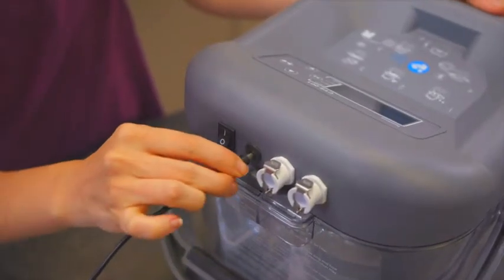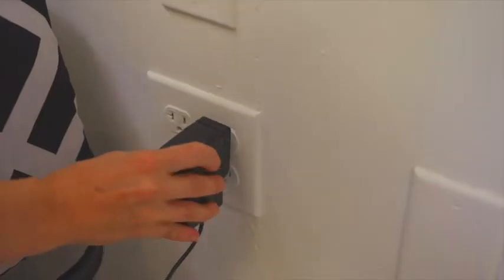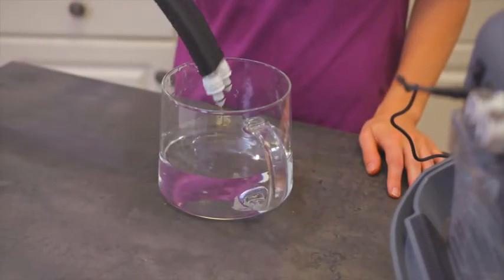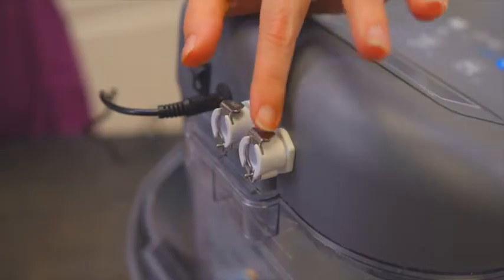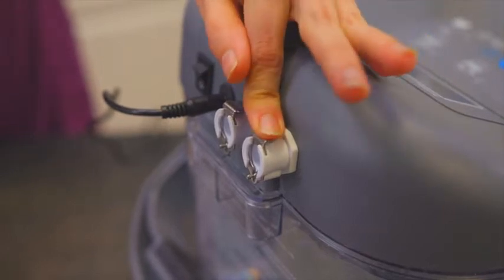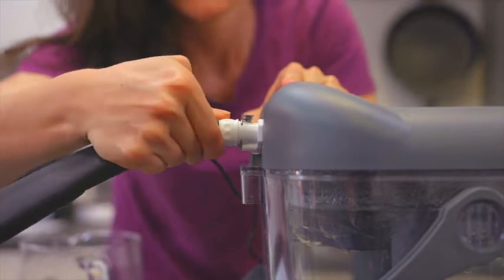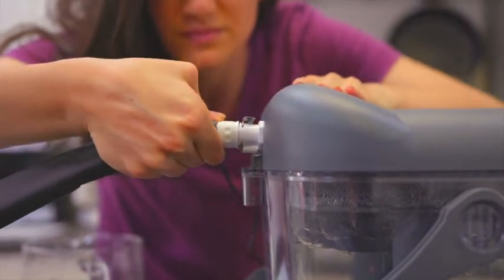Next, attach the power cable and make sure it is plugged into a working wall outlet. Before connecting the hose, slightly wet the nozzles and ensure each valve is unlocked by pressing down on the metal lock at the top of each valve. Make sure the nozzles are both pushed all the way in and that the lock has clicked into place.